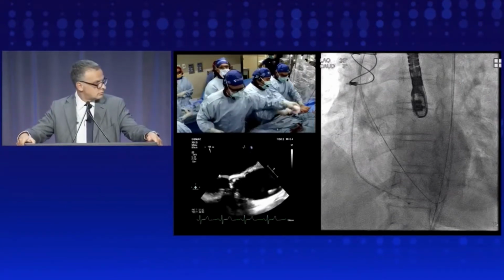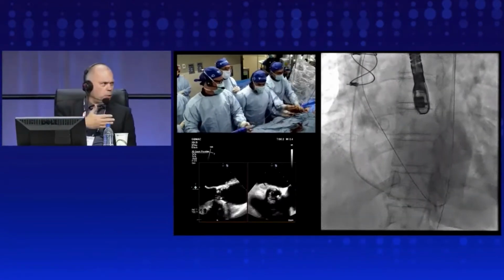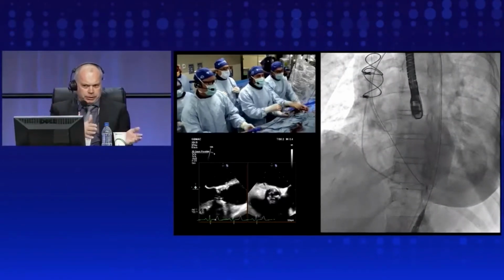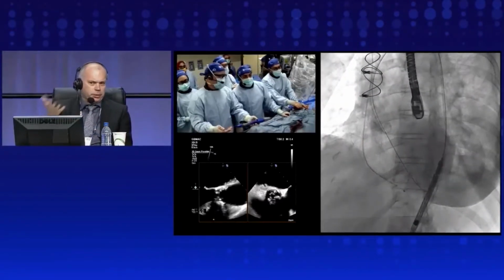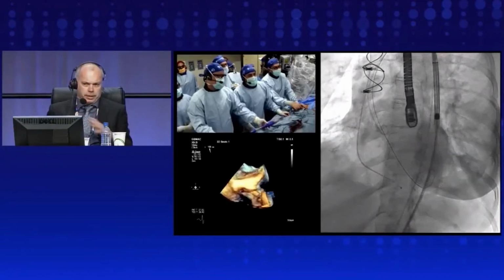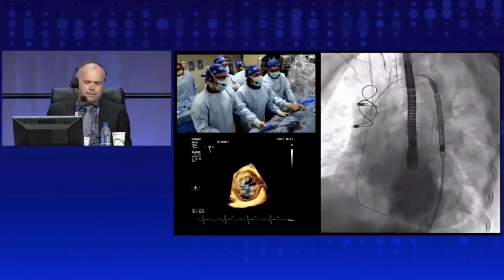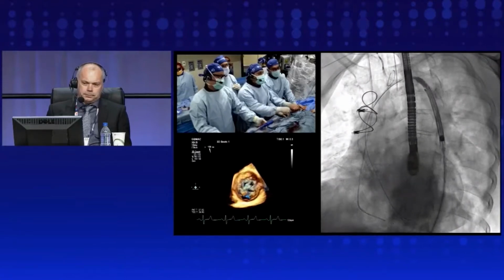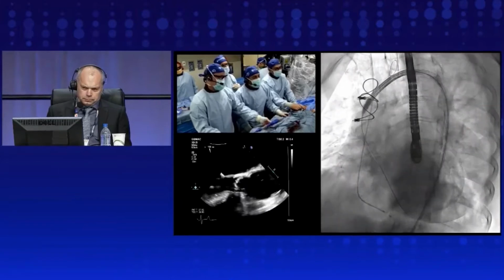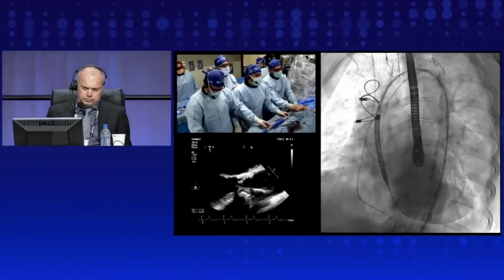There you go. So how do you decide which case to use it? Is it any arbitrary cut point of coronaries or using a simulation? When do you decide to do it, rather than just doing valve or cracking? When do you use the Basilica, you mean? Cracking the annulus of the surgical valve. When you go for it? I think that Basilica should be, honestly, the treatment of choice in TAVR, in cases at risk for coronary obstruction, in both native and stented and stentless surgical valves.